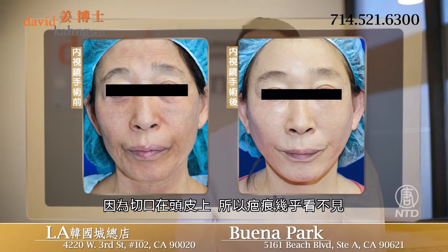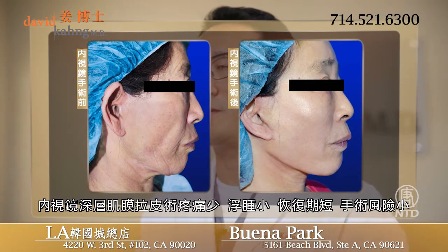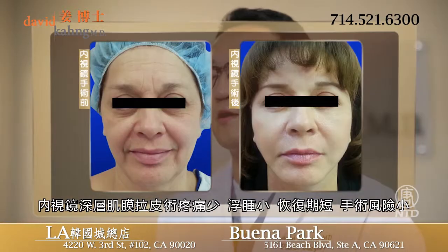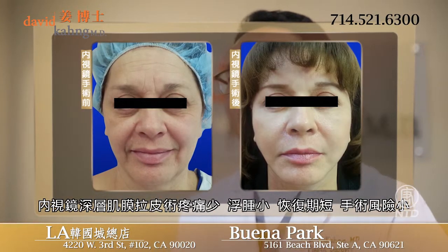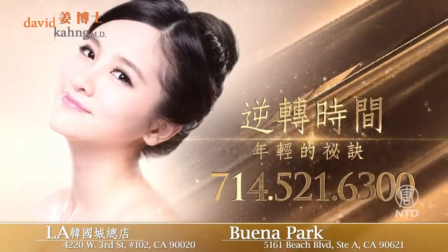The incisions are made in the scalp to minimize the visibility of the scars. The endoscopic approach allows patients to recover faster as well as to minimize the risk. Patients all go home the same day as an outpatient procedure.